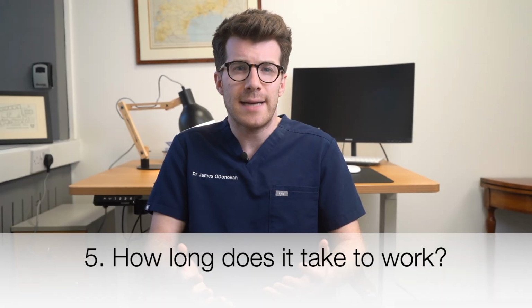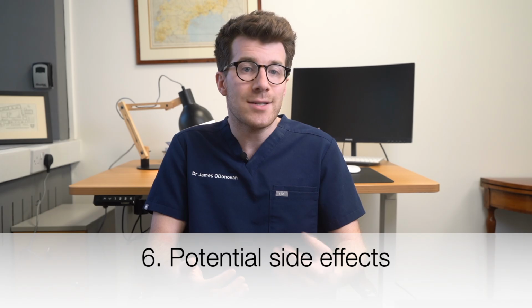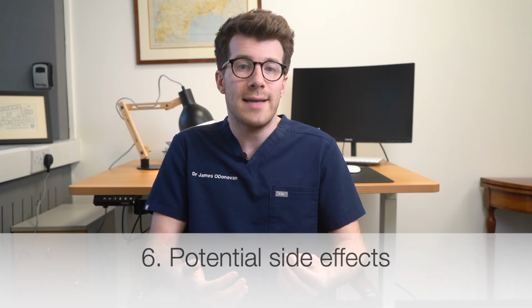So how long does it take to work? Well, in some people, they'll begin to feel relief from symptoms within 12 hours of using the medication. For other people, it can take 2 to 3 days. Now, for the best outcomes, don't be tempted to stop using the spray early, even if you feel better. It's always best to complete the course, and if you do want to stop, speak to your health provider first. If you've been using the medication for several months or longer, you should speak to your doctor to ask them to review your symptoms.